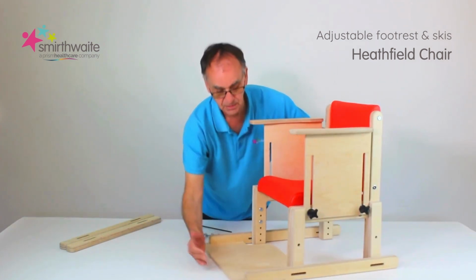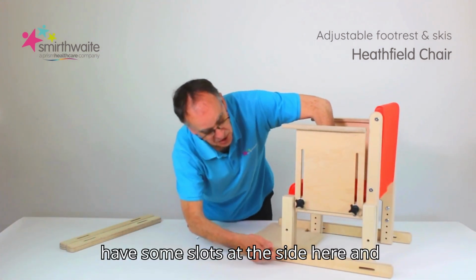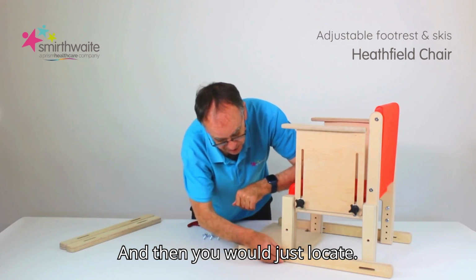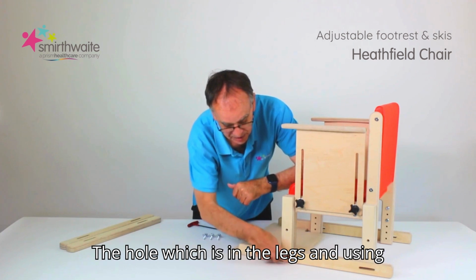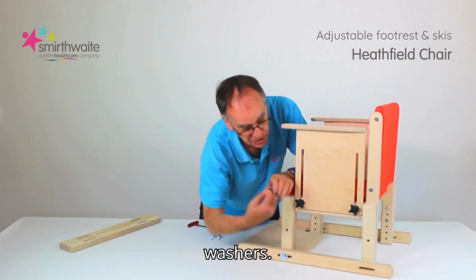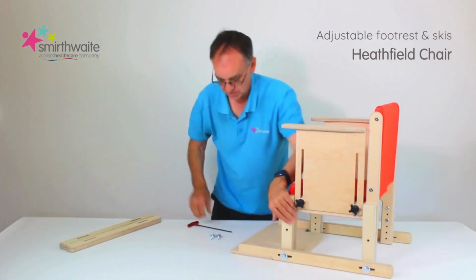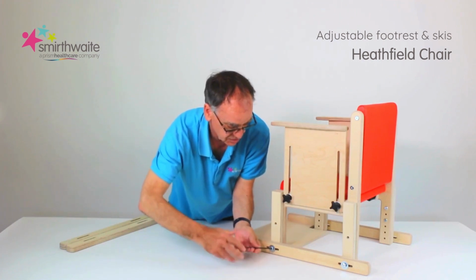and then we have some slots at the side, here and here on the ski part, and then you would just locate the hole which is in the legs, and using your bolts and washers, fasten these in place. Using your 4mm Allen key, tighten them up.